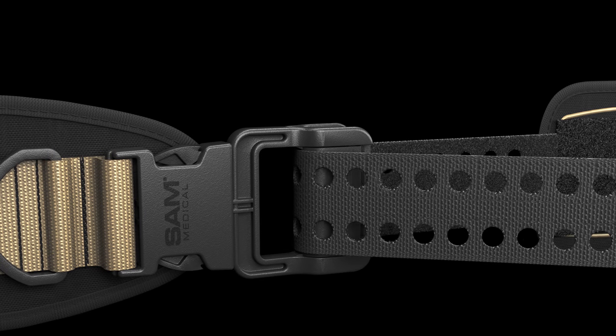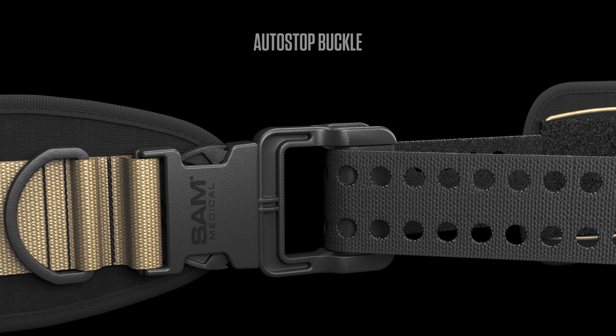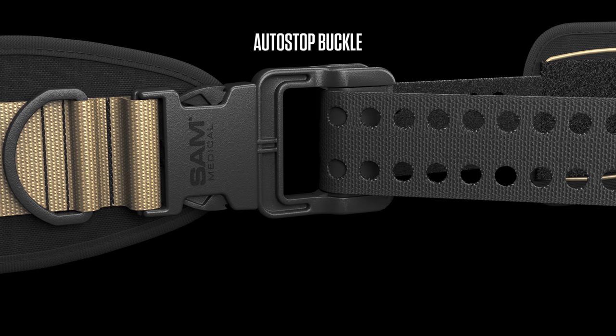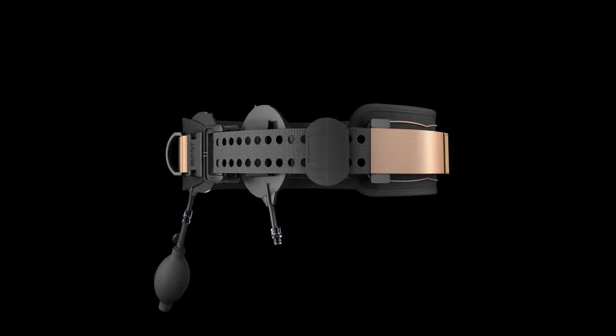Unlike the locking true force buckle found on the new SAM XT extremity tourniquet, the SAM AutoStop buckle does not lock, allowing you to quickly reposition the SJT for proper alignment if necessary. Learn more about the SAM Junctional Tourniquet at sammedical.com.